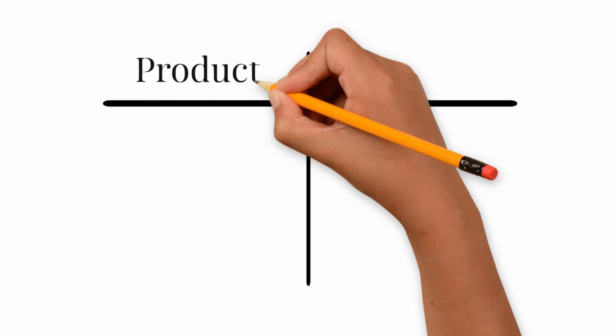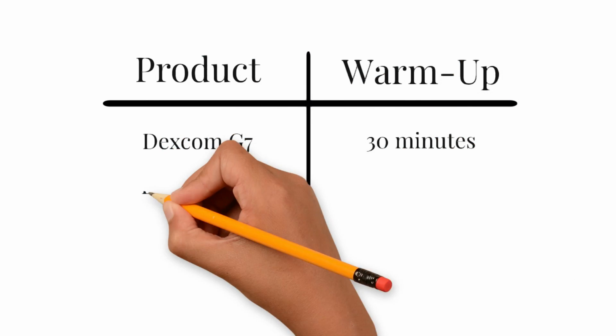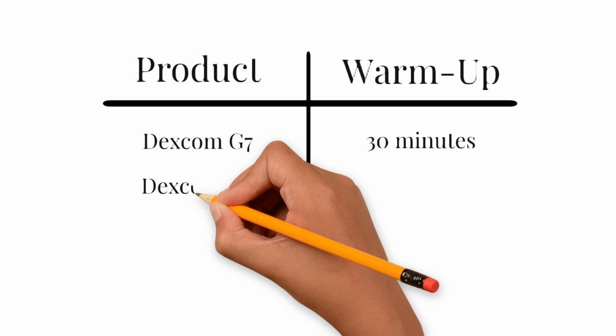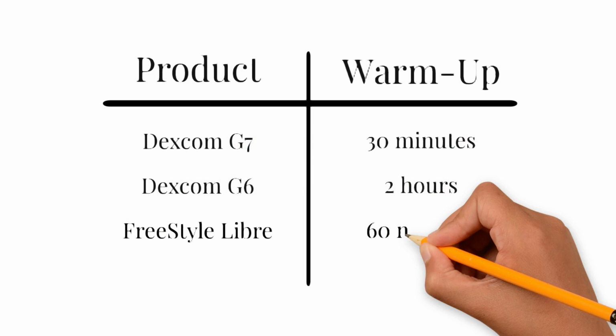You then insert the sensor and the warm-up period starts. There's a 30-minute warm-up period. Once you then start it in the app, you can follow along and see how much is left of the warm-up. You will not be receiving any blood sugar numbers during that first 30 minutes, but after that, you'll be able to see your blood sugar readings in the app. A 30-minute warm-up is pretty brilliant. Dexcom G7 was the first to introduce a 30-minute warm-up, whereas previous Dexcom versions had a 2-hour warm-up, and the Freestyle Libre is 60 minutes.